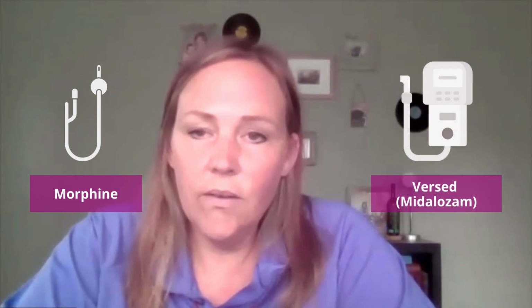I had a gentleman that wanted to be removed from his ventilator, and he wanted to do that at home, and he wanted to do it with his family present. It was really important to him, so we did get approval to use the catheter for morphine administration, and then we were using a CAD pump for Versed administration. We had been there probably 4 hours.